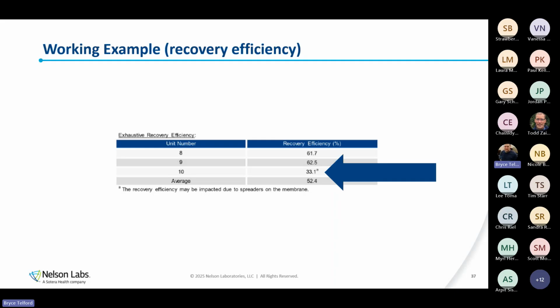So there actually is wording in the standard about overestimation of bioburden and how it can affect our validation. Sometimes a recovery efficiency being low might be seen as a worst case when it comes to dose setting, and I'll make sure that we address this when we do an example dose setting. We may be biasing ourselves higher and actually creating less of a challenge, which could be seen as problematic for a regulatory body. So that is a good question, and we'll get to it.